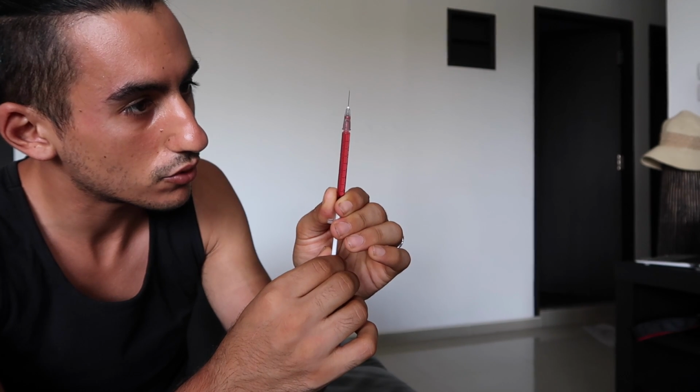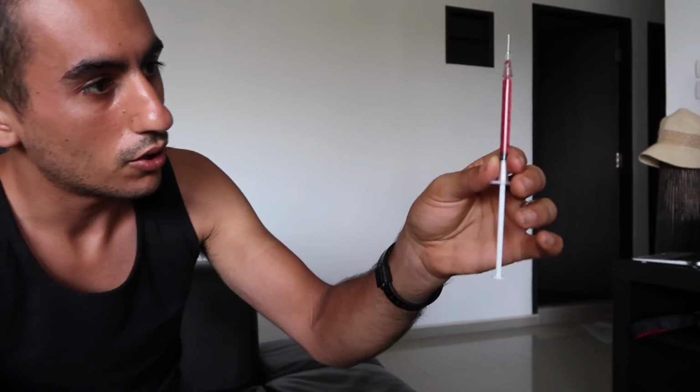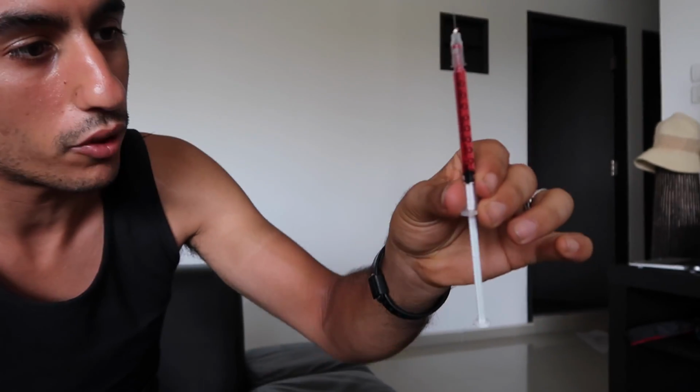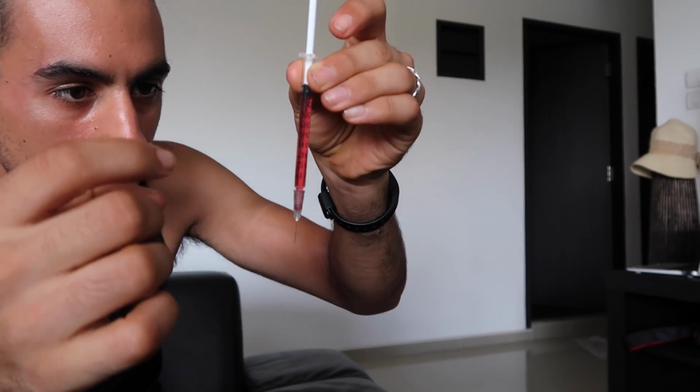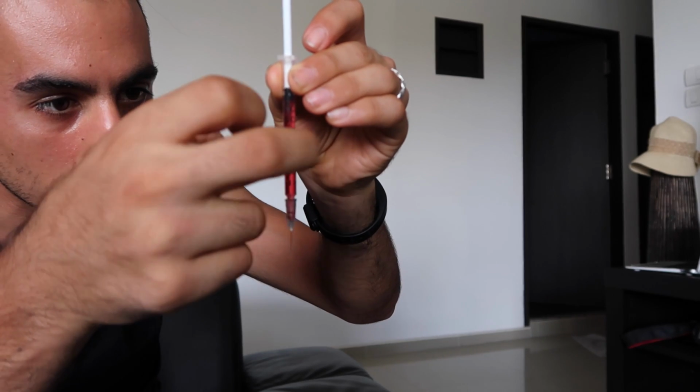Get out and then push it all the way out. Now, the best way to tell if you've got all the air out is when you flip it upside down to inject yourself. Hit it a few times. You can see there's a few air bubbles still getting through.